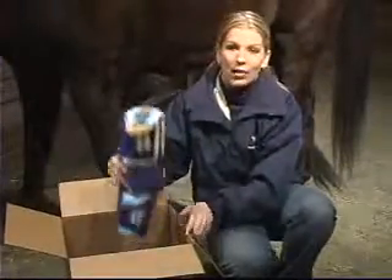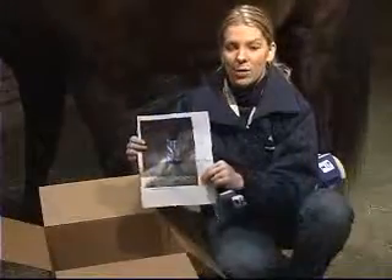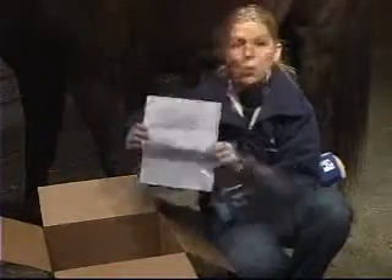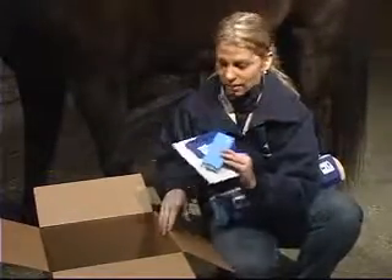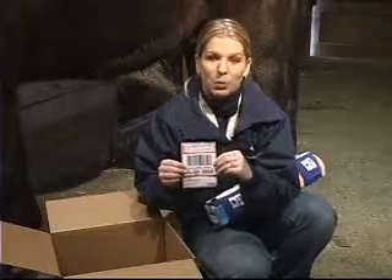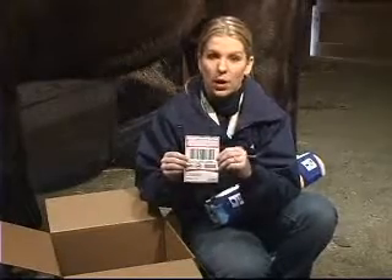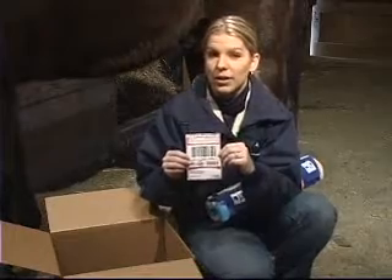Your Dynasplint System will arrive fully padded and labeled, ready to apply to the animal. In your box, you will find photographs, written fitting instructions, a treatment schedule that your Dynasplint Sales Consultant has designed specifically for your animal, additional padding that will be necessary throughout the treatment process, a screwdriver used to adjust the tension throughout the duration of the treatment, and a FedEx prepaid label. Please save this label as well as the box, as you will need them when you and your consultant have decided that your animal's treatment is complete.